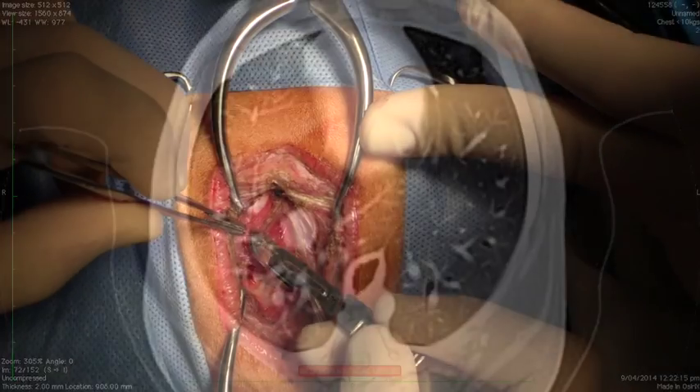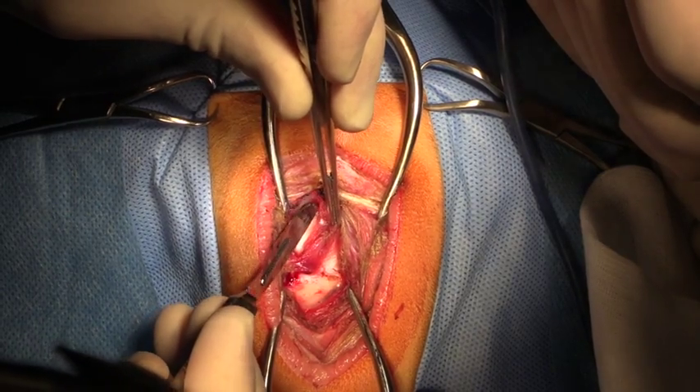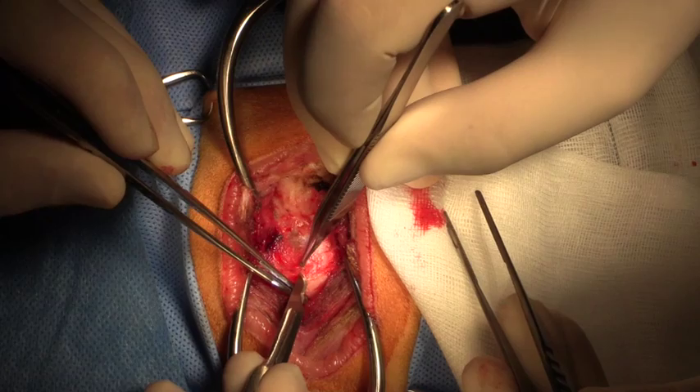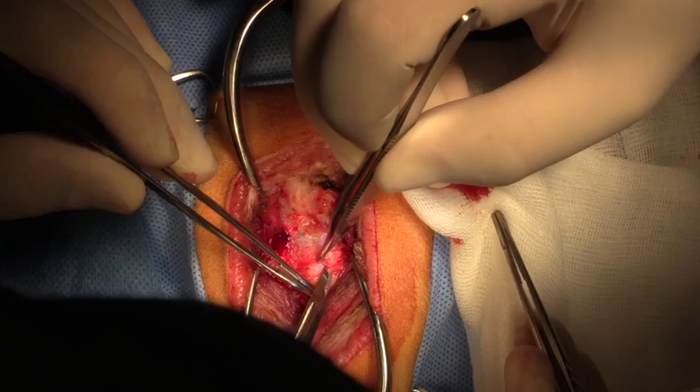We had the patient positioned with its head down toward the table and we made an approach to the caudal occipital region. With the head bent forward we are able to dissect down to connective tissue which was just over the cisterna magna in this patient.